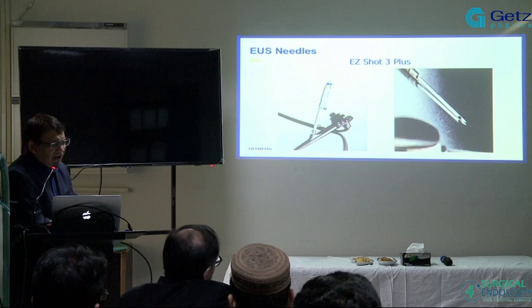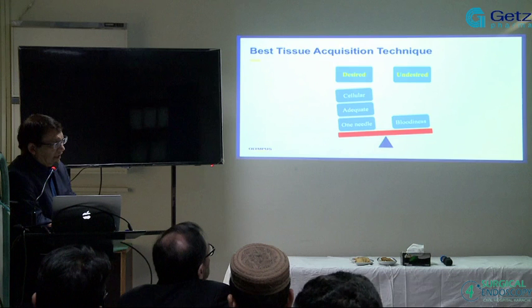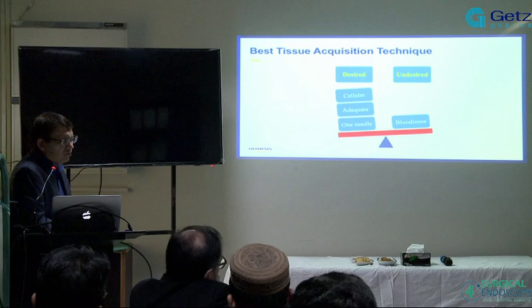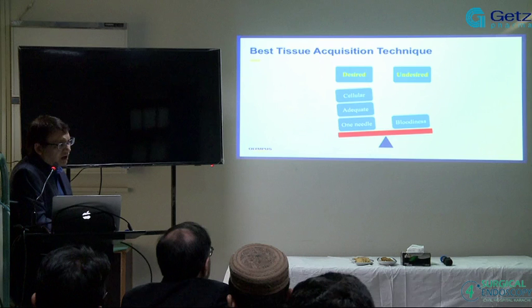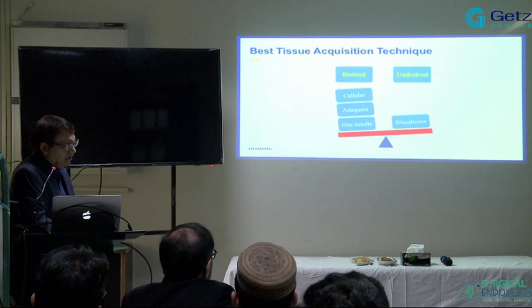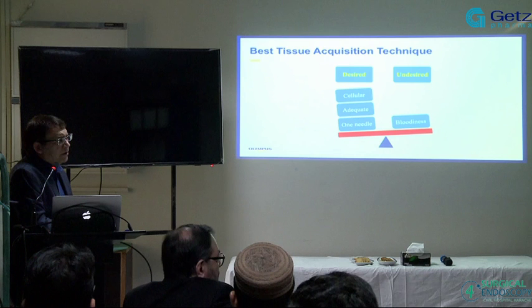It's a sheath, a little different. It's a metallic sheath, kind of, and very flexible. Which needle do we use? Just a regular injection needle. Do you use Olympus or Carlock, which needle do you use here? Just like regular injection. Sclerotherapy? Yes, sclerotherapy or some mucosal. Whichever is available.